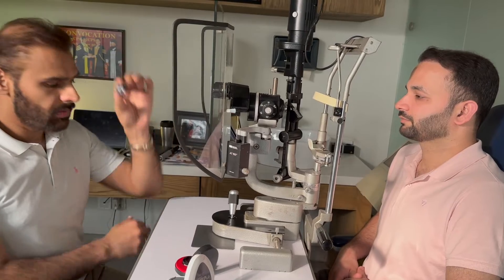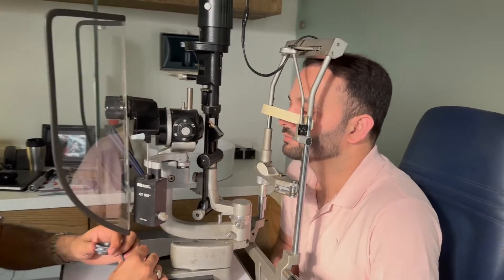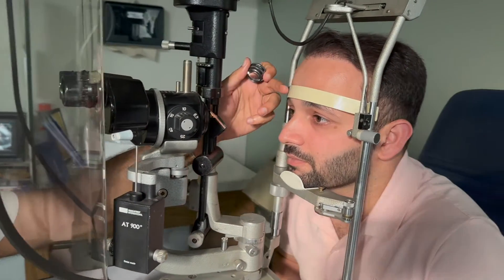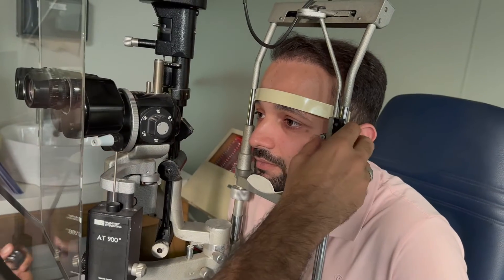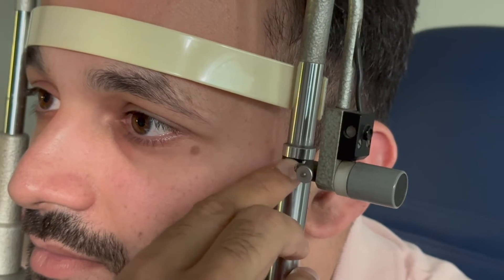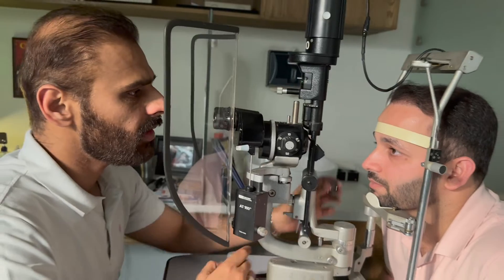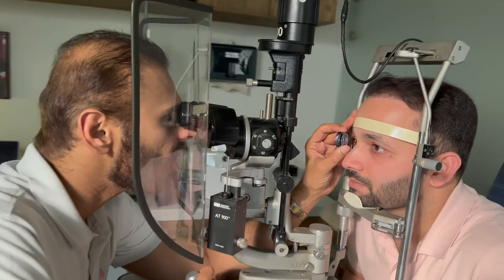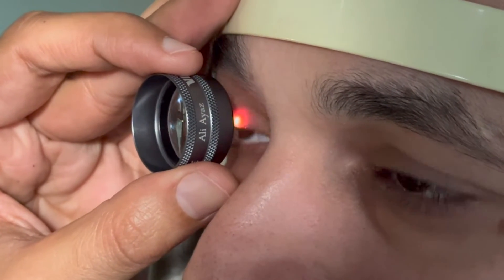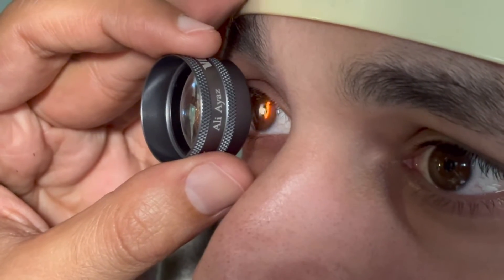When doing a slit lamp examination with indirect ophthalmoscopy for the right eye, you will hold the lens in your left hand. Ask the patient to put their chin on the chin rest and forehead against the forehead rest, with the canthus at the level of the gauge. Ask the patient to look at your ear, then introduce the lens between yourself and the patient to look at the fundus.